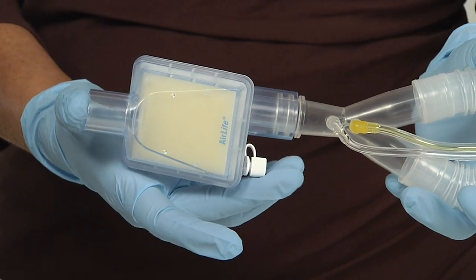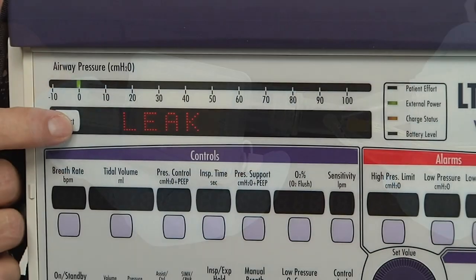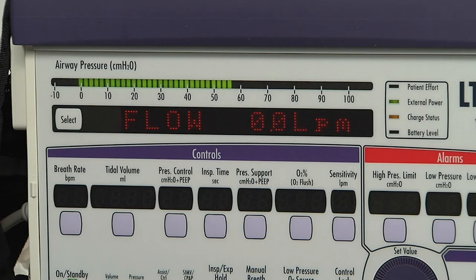With a clean gloved hand or 4x4 gauze pad, block off the patient end of the circuit. Push the select button while 'leak' is visible in the display window. Performing the leak test will take the ventilator several seconds. After several seconds, the display shows 'Leak Pass' or 'Leak Fail,' indicating the leak test results.